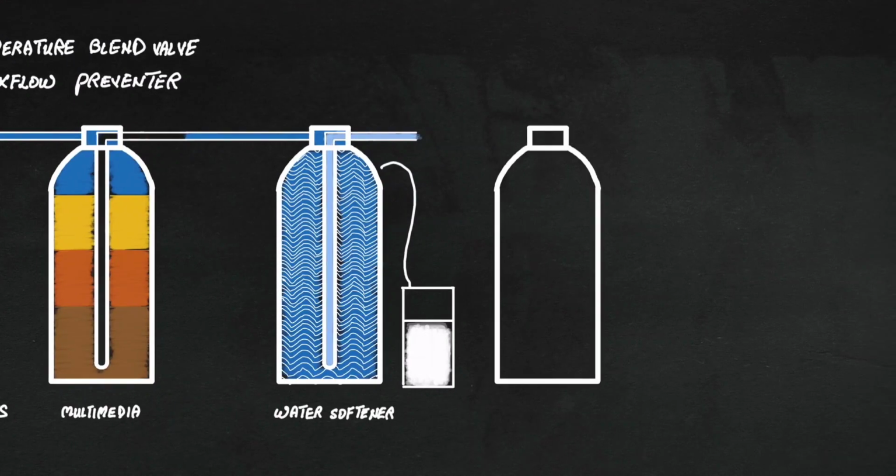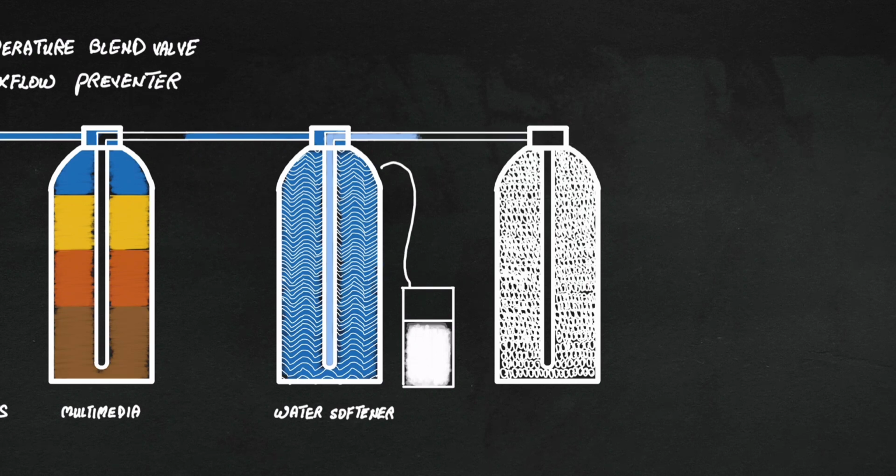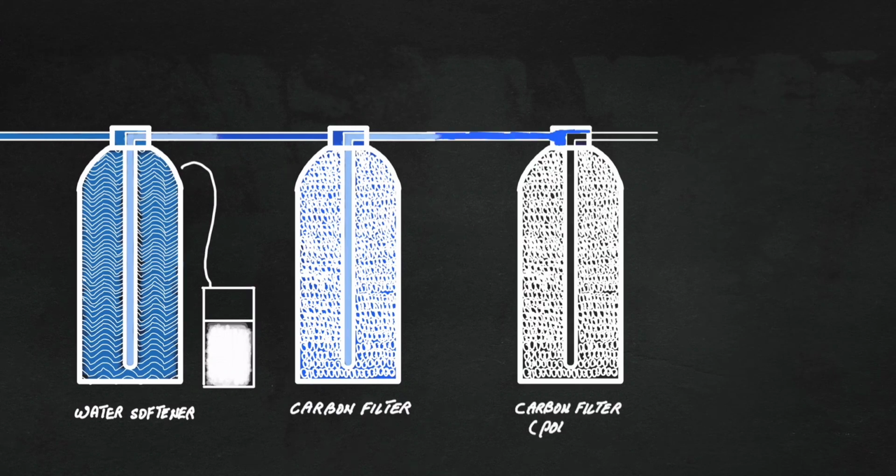The next step in water pretreatment is carbon filtration. This is accomplished using a pair of filter tanks containing granular activated carbon. Their job is to dechlorinate the feed water. The first tank, usually nicknamed the primary or worker tank, should be able to get chlorine levels to less than 0.1 parts per million prior to feed water going through the backup tank, also called the polisher.